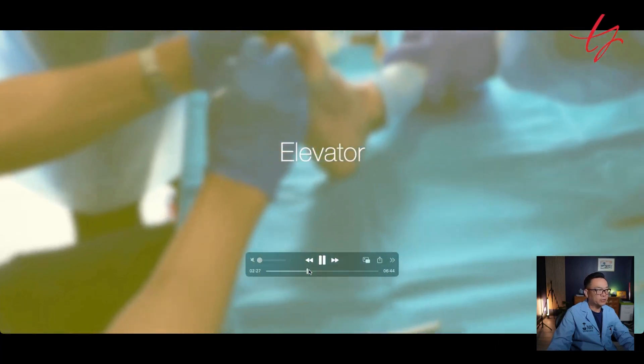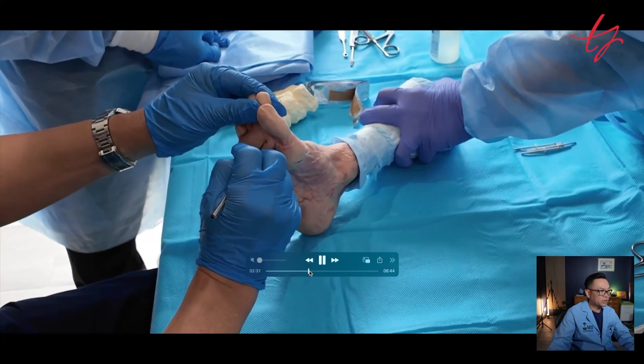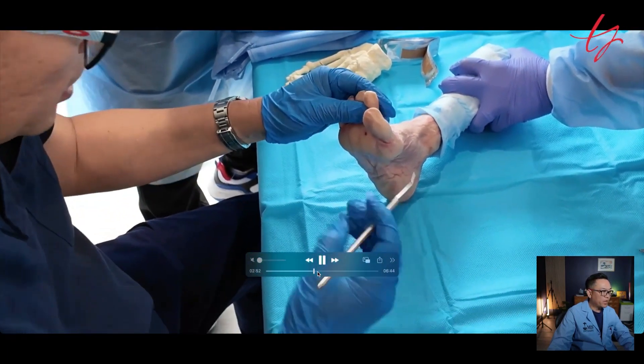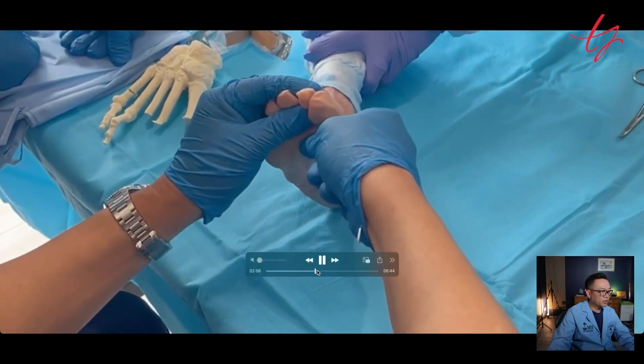The extensor tenotomy was done before. Use an elevator to create a nice portal, and then this is rasp action — you rasp where you're going to make the osteotomy.